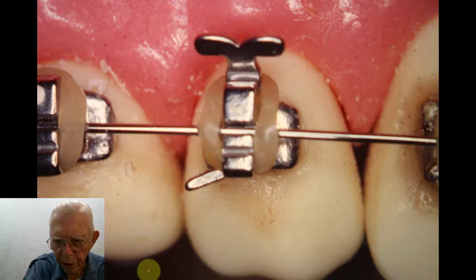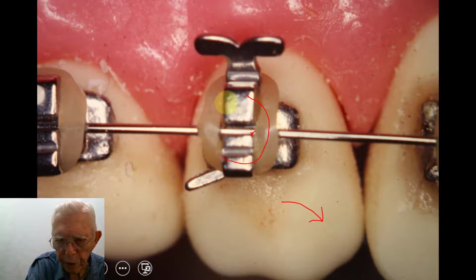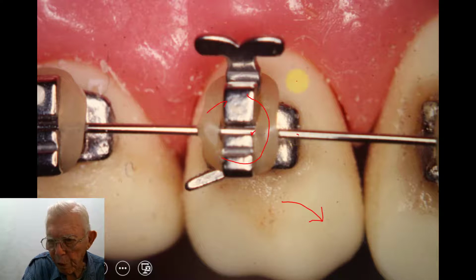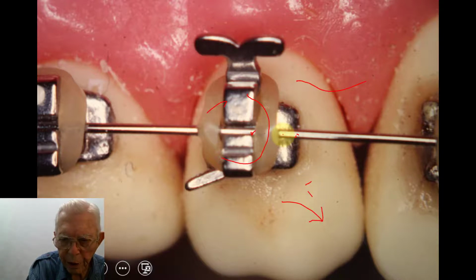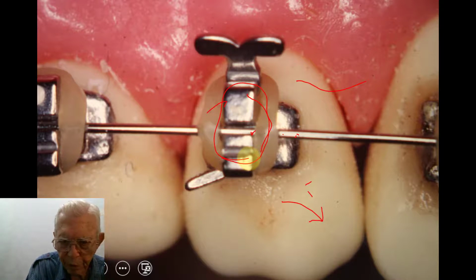If you're trying to rotate it and the tooth is in on this side over here and you want to pull it around, the arch wire will not fit tight on this side. So we put wire underneath it here, and then we press in on the wire over here so that wire will have a slight bend in it, and that'll help bring this side back out again. So we wire it in instead of putting a little rubber band or little plastic O-rings around the brackets like that. And normally this does all right.